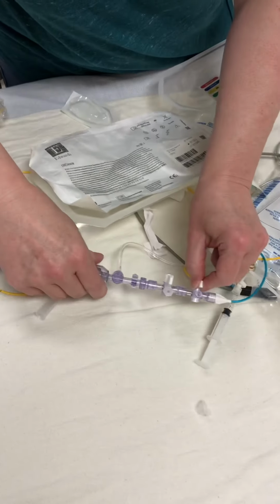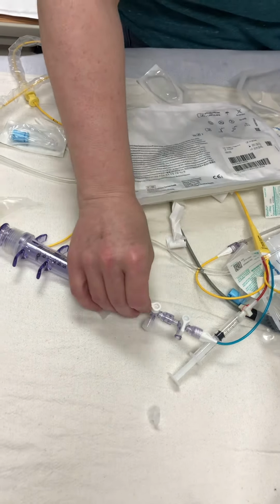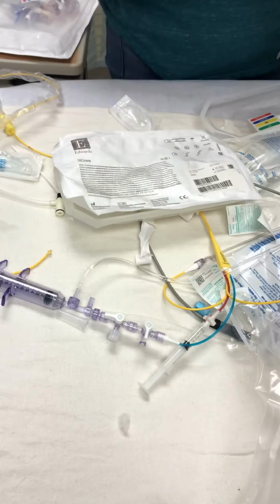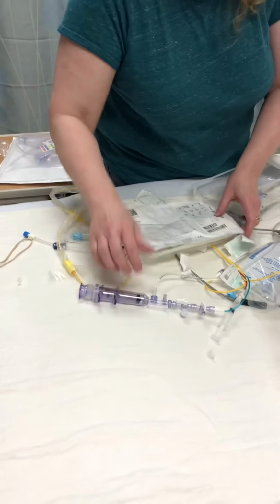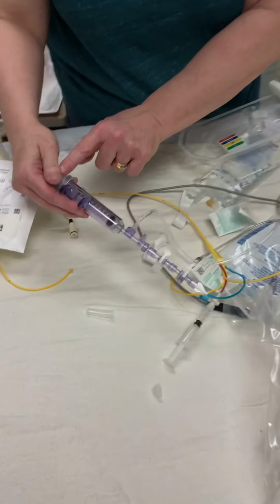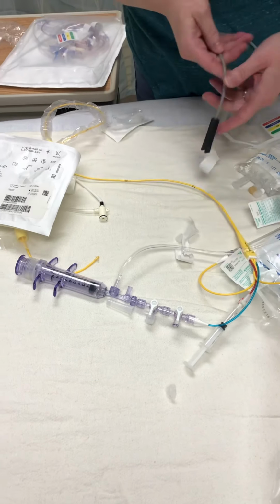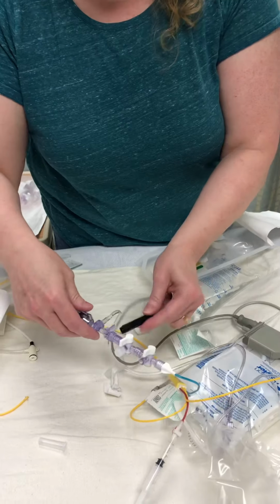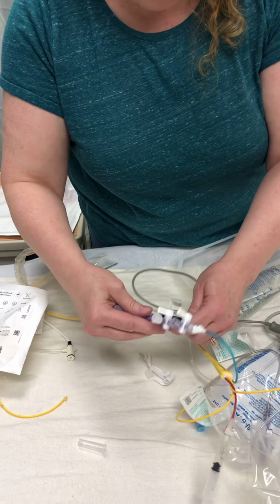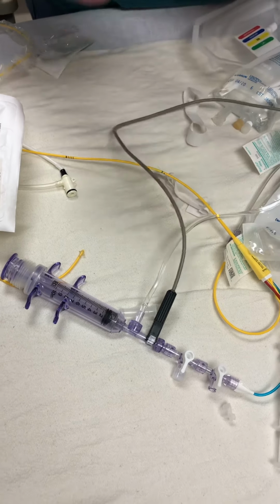Normally, on a regular basis, when you're not checking your cardiac outputs, you'll have it like this. So your maintenance fluids are going through here to keep your line open. When you are doing a cardiac output, you're going to have this like here so you can have a nice straight shot of fluid through here. Also, when you first set this up, this is the little sensor that measures the fluid that goes past. So that's how that's gonna be.